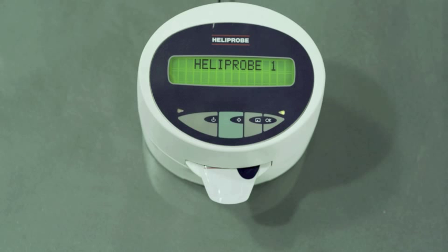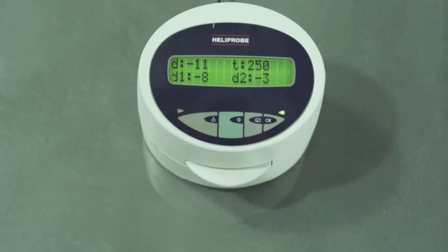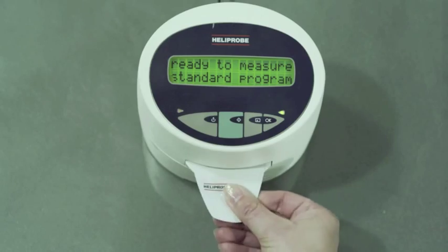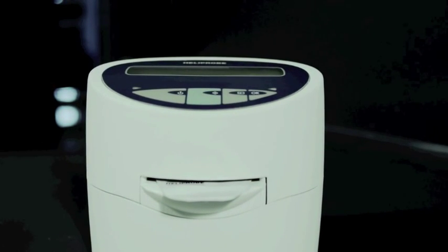In case of a borderline result, the system will automatically reanalyze your test twice. Remove the breath card. If you want to see the counts, press OK twice. Insert the protection card. Remember to print or record the results for future reference. The Heliprobe system from Kibion offers fast and reliable diagnosis of Helicobacter pylori. It's suitable for test and treat and follow-up after treatment.